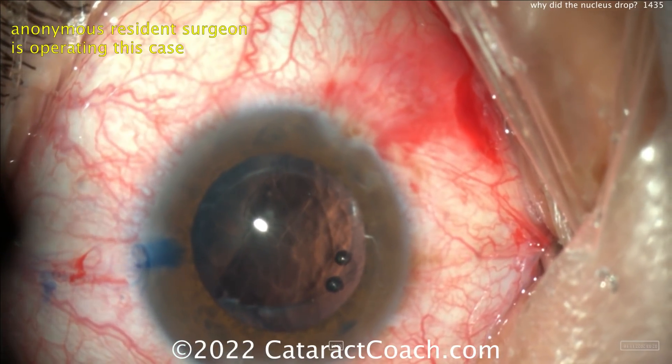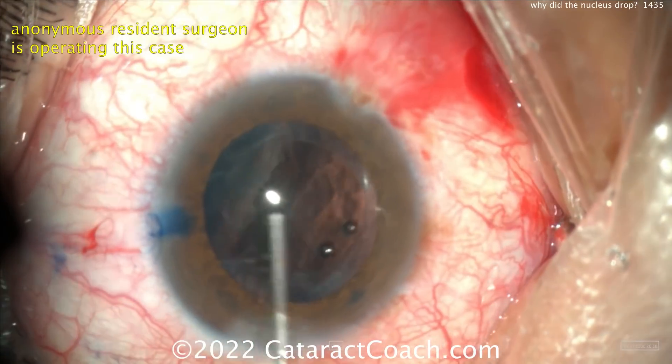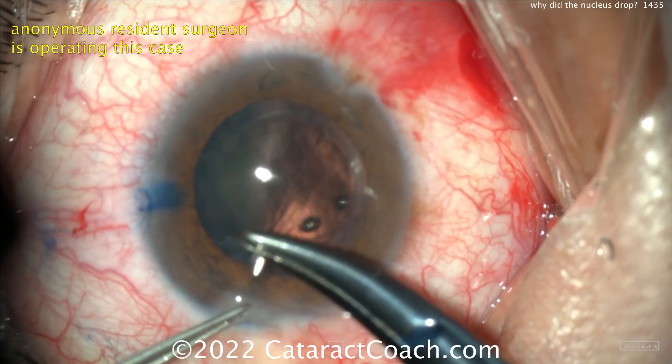Now, what should you do? Let's clean up the front of the eye. A little bit of sweep there. You may want to put some triamcinolone to stain the vitreous. You're probably going to have to do some sort of anterior vitrectomy. Then close up the eye — put a suture in that main incision.